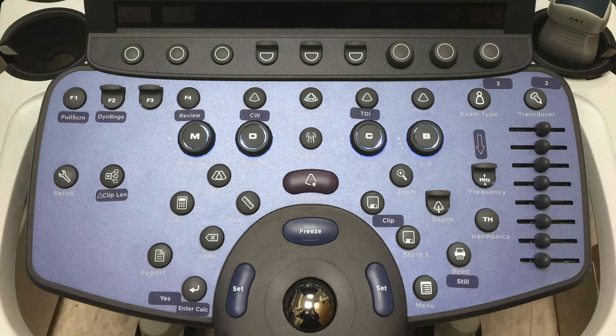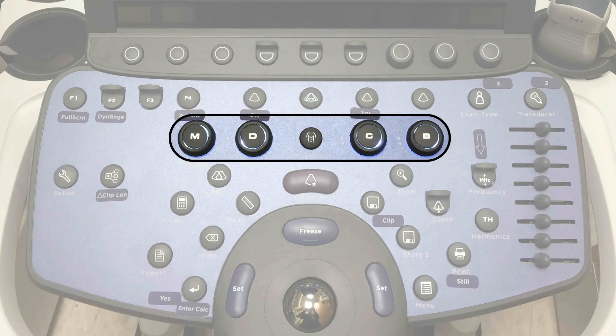There are different modes of ultrasound available on the Zonari ZS3 system. To activate each one, there are dials and buttons highlighted on the panel. The modes are: B mode, color Doppler, spectral Doppler, and M mode. The button with the label will be pressed to activate that mode.